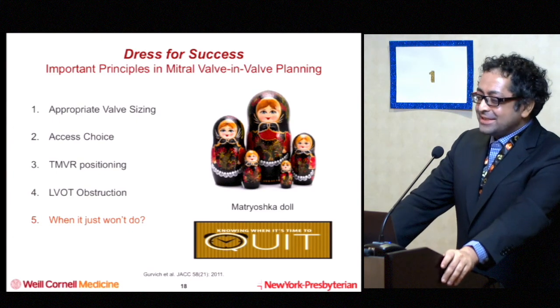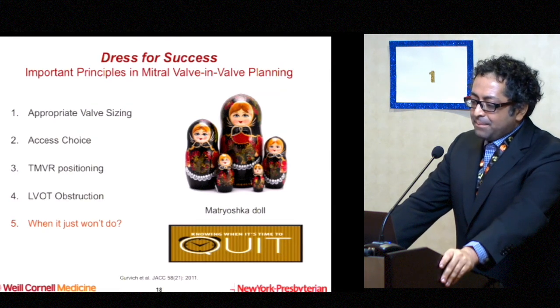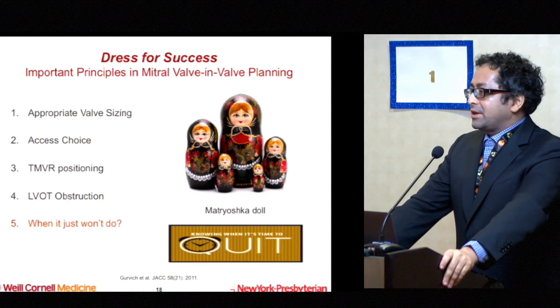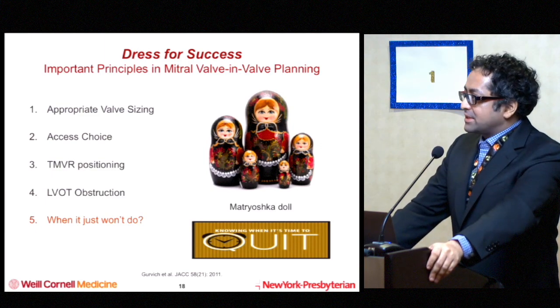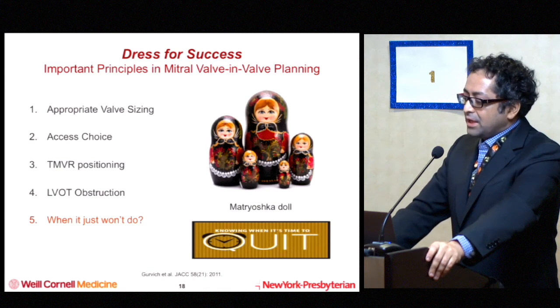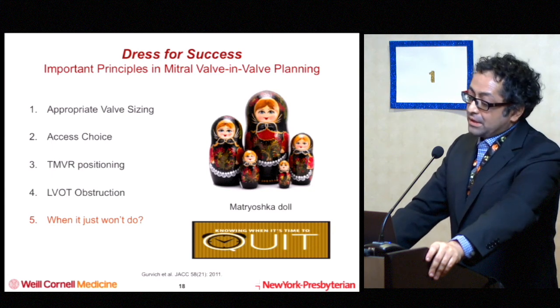And the other thing to remember with this is, if the patient is non-operative, fair enough, do what needs to be done if they're very sick. But when should you not do things? Well, if the mitral valve in there is so small that the next level mitral valve is going to create a significant gradient in and of itself, just like the telescoping principle that we all think about in this field, maybe that's not a time to do it, especially if they're high risk and you can convince a surgeon to think of another approach.